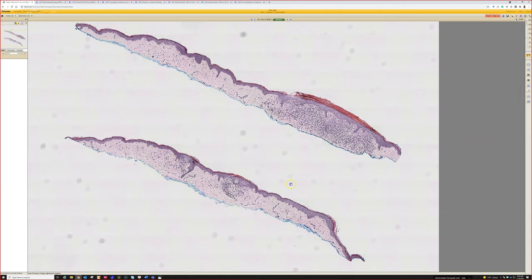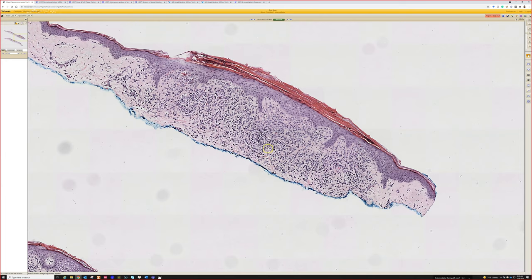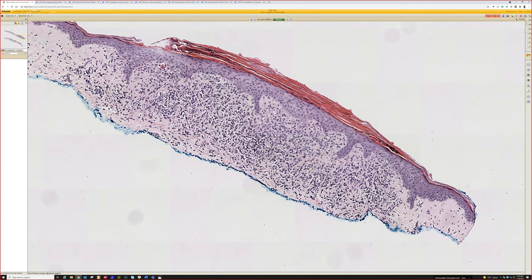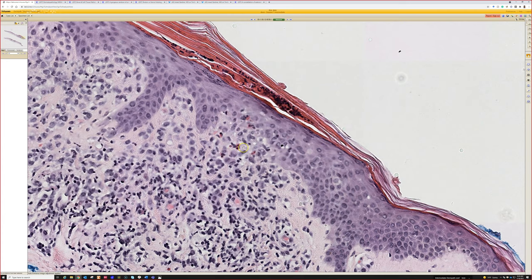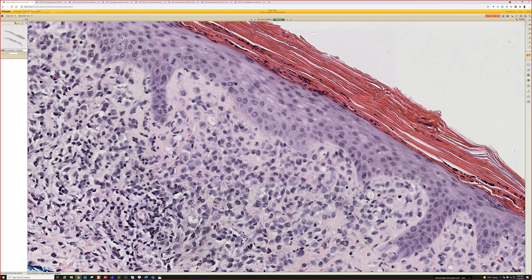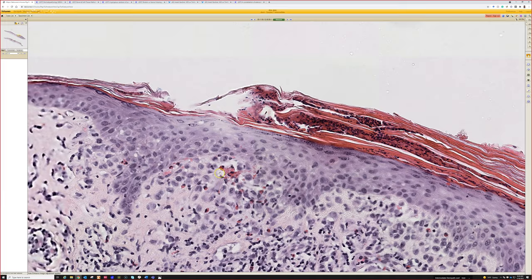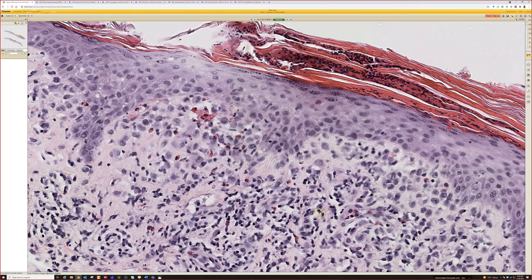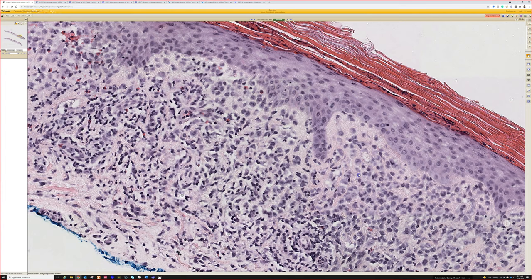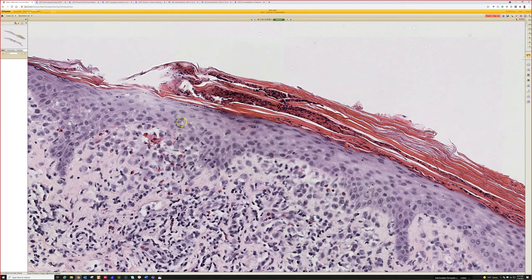Case twelve. It looks like there's an infiltrate in the dermis — kind of those gray cytoplasm cells we were talking about, so like histiocytes mainly, some lymphs in there as well. And some of these are going into the epidermis. LCH — Langerhans cell histiocytosis. It is a papillary dermal infiltrate of mononuclear cells that look a lot like histiocytes, often with some eosinophils, and it tends to trickle into the epidermis. The other thing that likes to fill the papillary dermis is mastocytosis — mast cell disease or urticaria pigmentosa — but mast cells respect the boundary of the basement membrane and do not enter the epidermis.